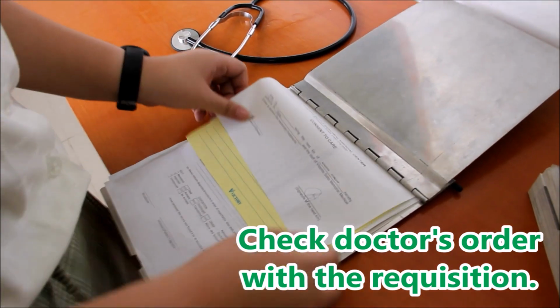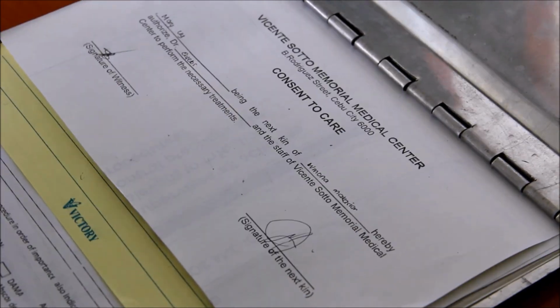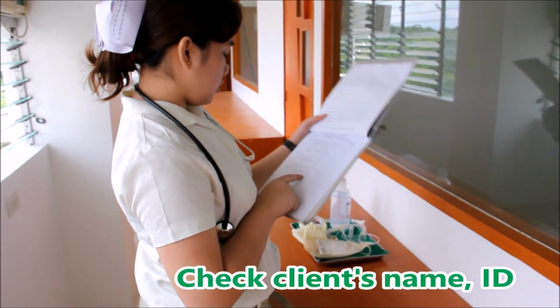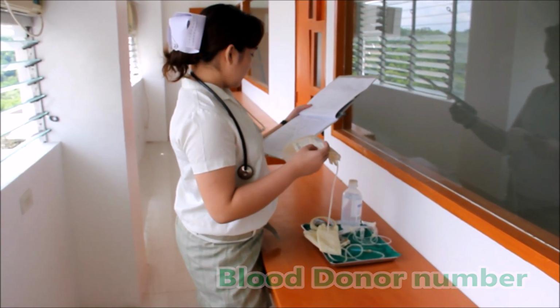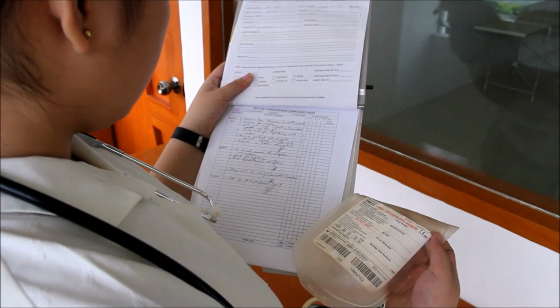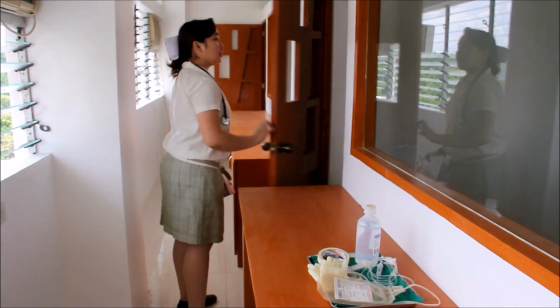Check the primary care provider's order with the requisition. Check the requisition form and the blood bag label with a laboratory technician or according to agency policy. Specifically, check the client's name, identification number, blood type and RH group, the blood donor number, and the expiration date of the blood. Observe the blood for abnormal color, RBC clumping, gas bubbles, and extraneous material. Return outdated or abnormal blood to the blood bank.